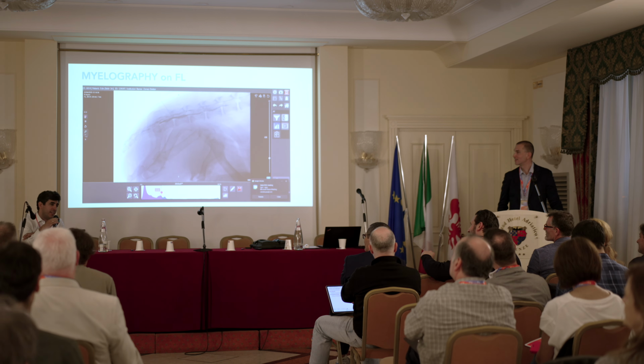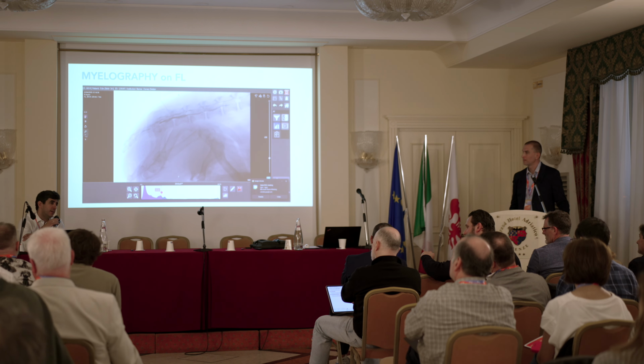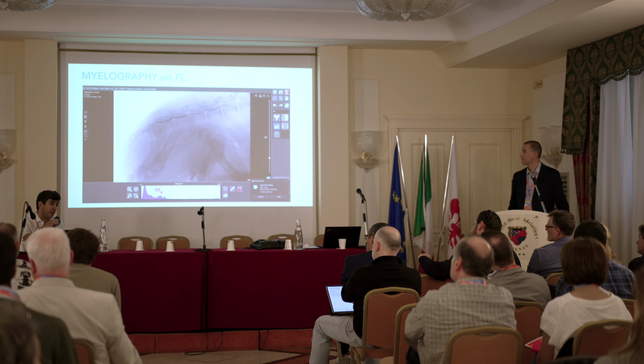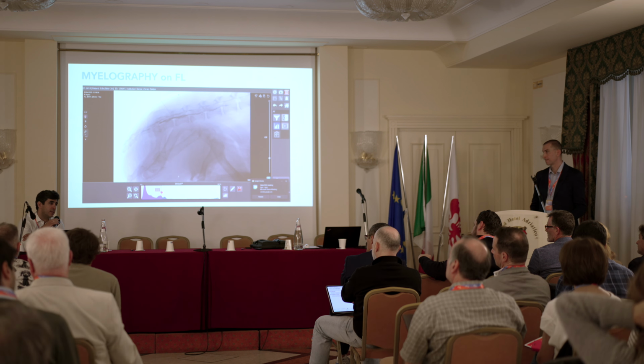So that was a very nice question. Usually what we suggest is to do a plain CT for brachycephalic dogs. You can see the mineral material in the vertebral canal, so you don't do intravenous contrast medium or myelography. In 80% of cases, if it's surgical, you can see it on the plain scan, so we stop the scan there.